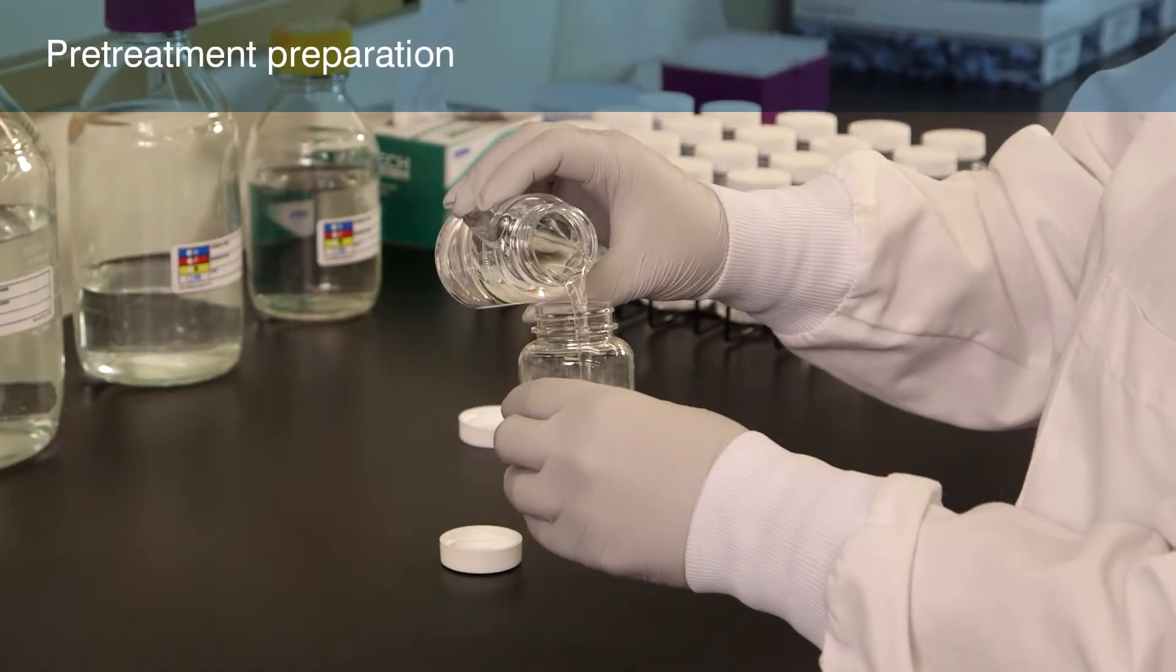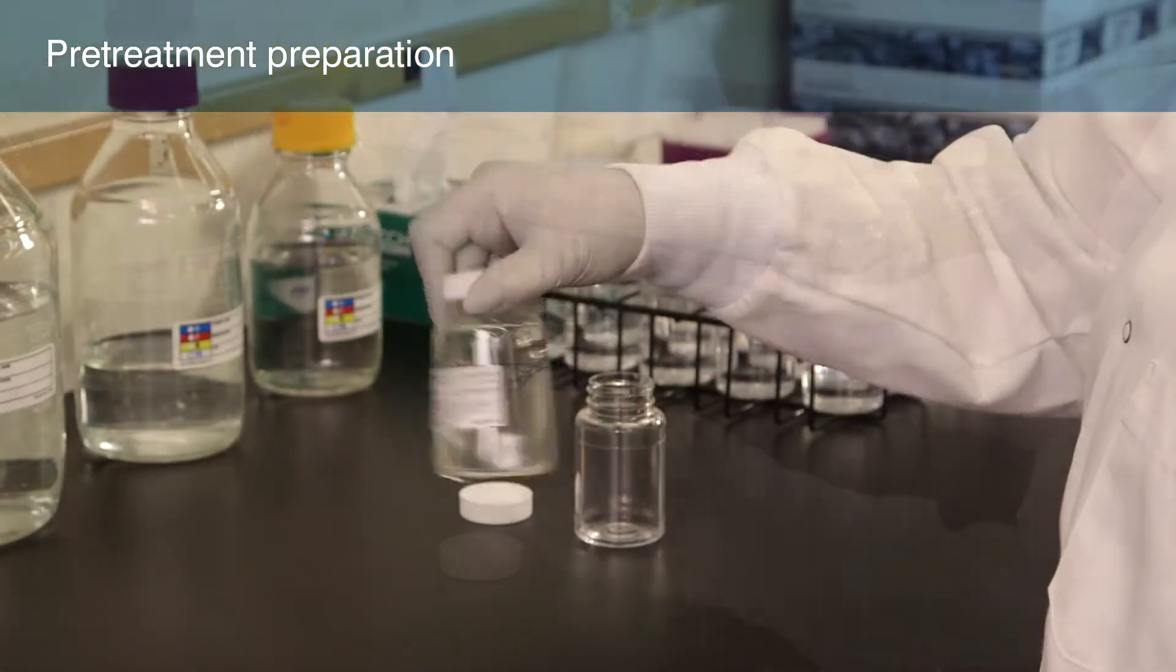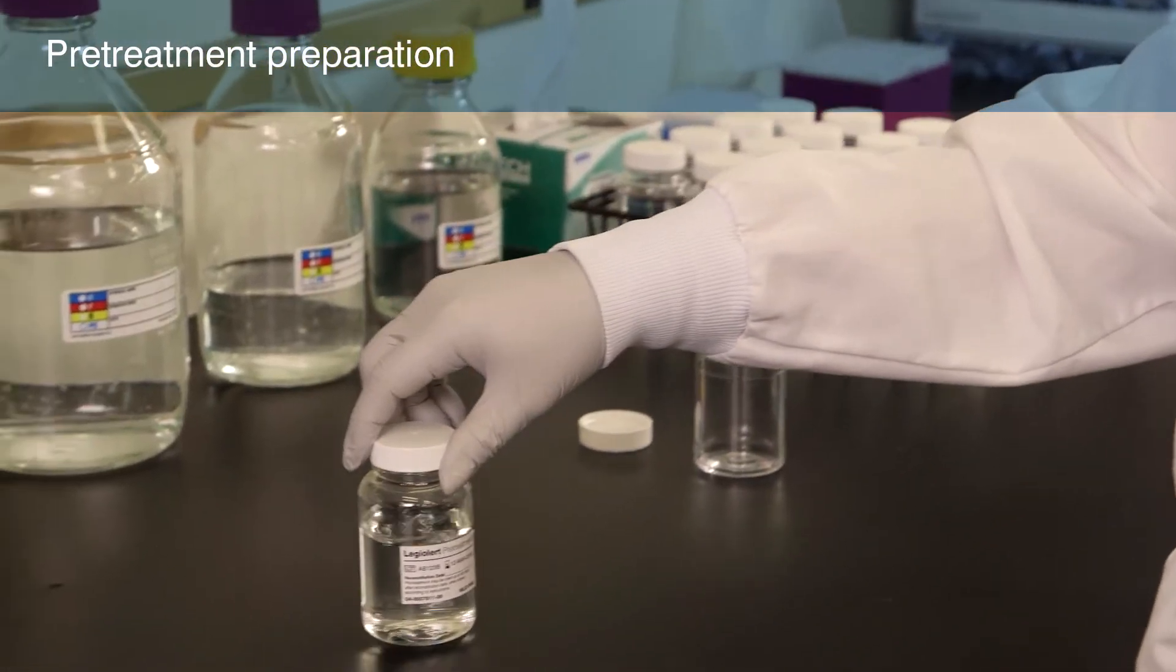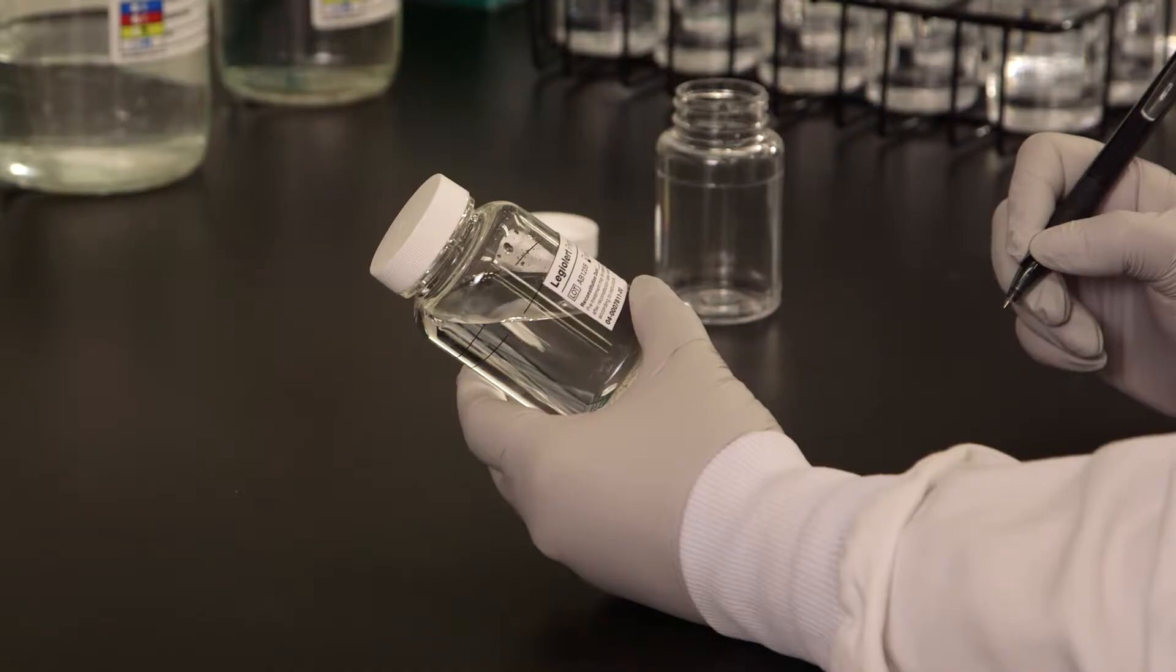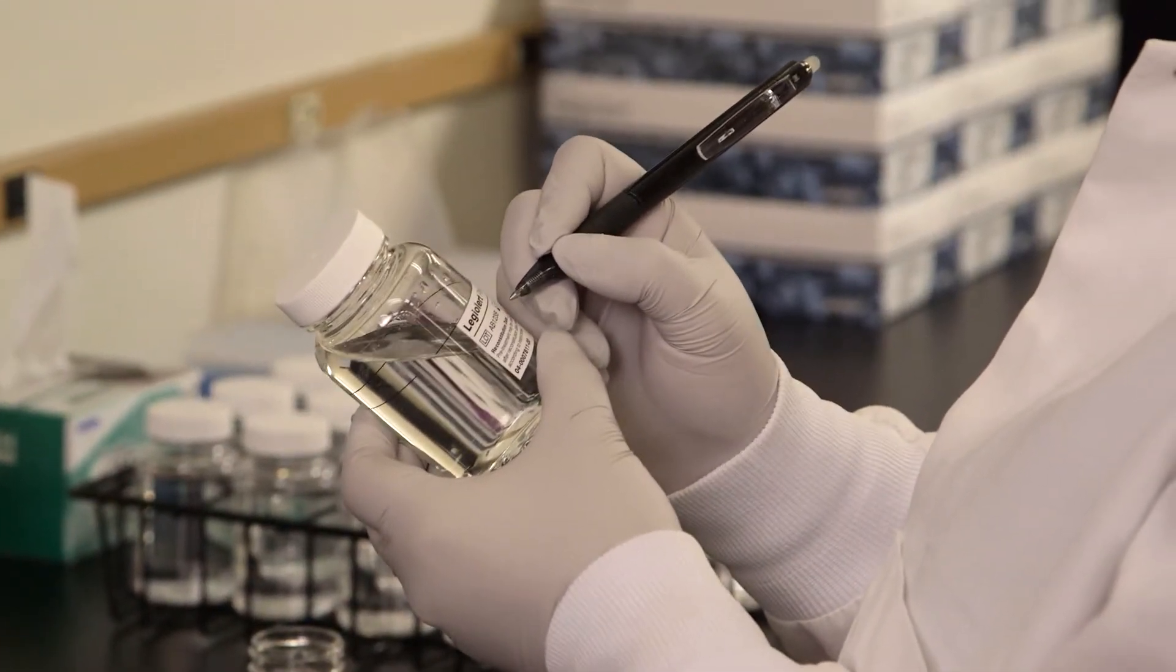Reconstitute the LEG-ALERT pretreatment by adding 100 mL of sterile DI water to the vessel and then shake until fully dissolved. Mark the preparation date on the bottle. Refer to the LEG-ALERT pretreatment product insert for more information.